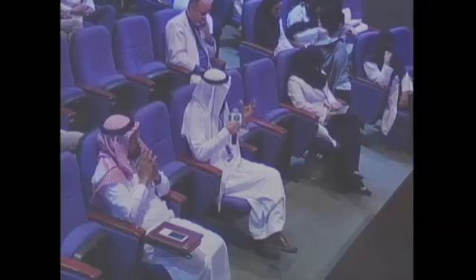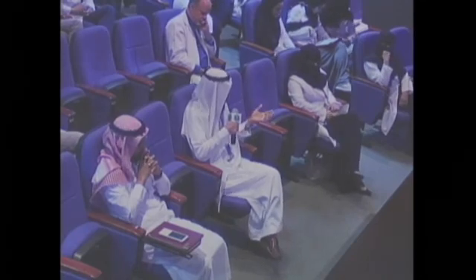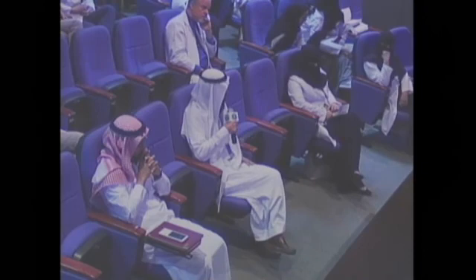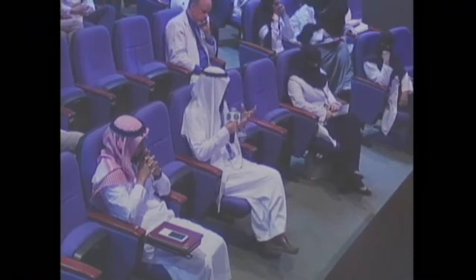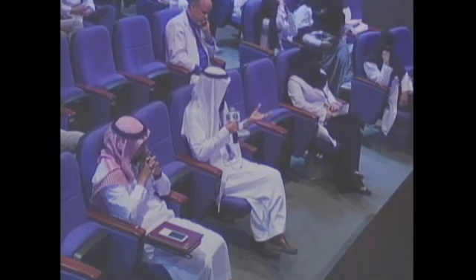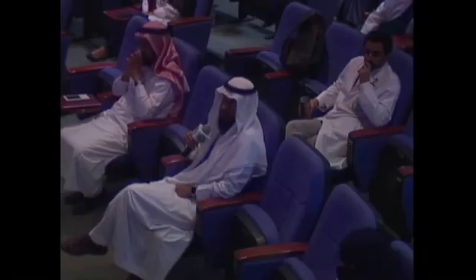Questions? Thank you very much, Dr. Suarez. And now for myopes over the age of 40, if they are asking for refractive surgery, instead of monovision, you can correct them fully, and then you can use any of the devices like the Kamra for the reading part of the myopic patients. Do you have experience with this? Do you prefer it over monovision, or do you still go for monovision?